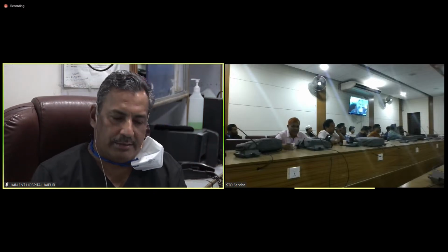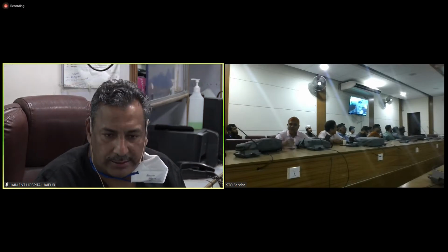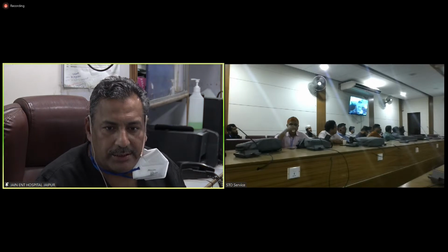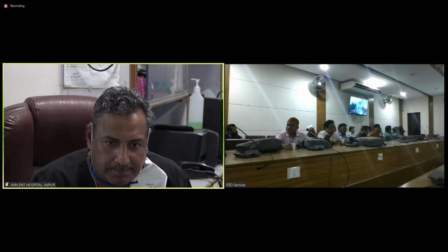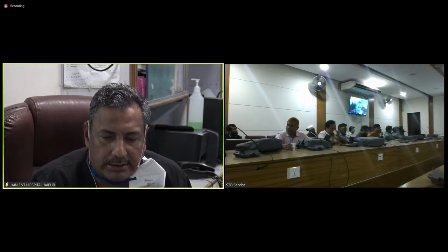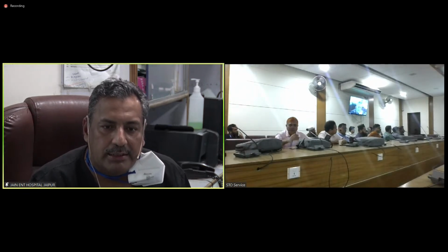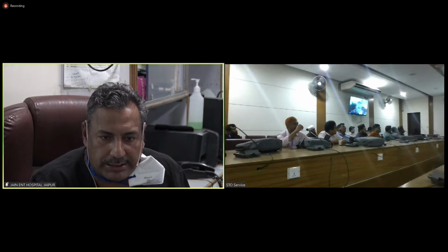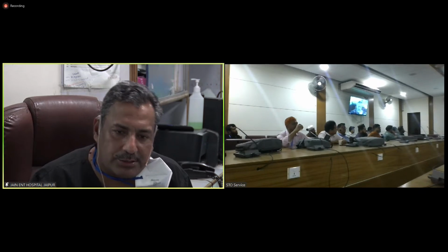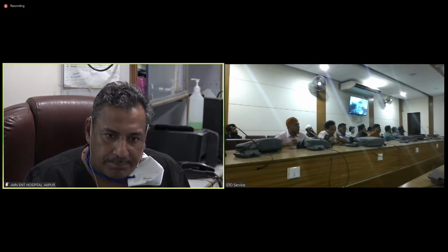Your question is valid, and that's why I put this surgical case in order. There has been a lot of debate regarding the surgical tool for adenoidectomy: microdebrider, adenoid curette, coagulator, harmonic scalpel, cautery. There are so many ways to remove this hypertrophic adenoid tissue. We need to know the pros and cons of all, and that's why I kept this case, and that's what I'm going to discuss during the surgery.